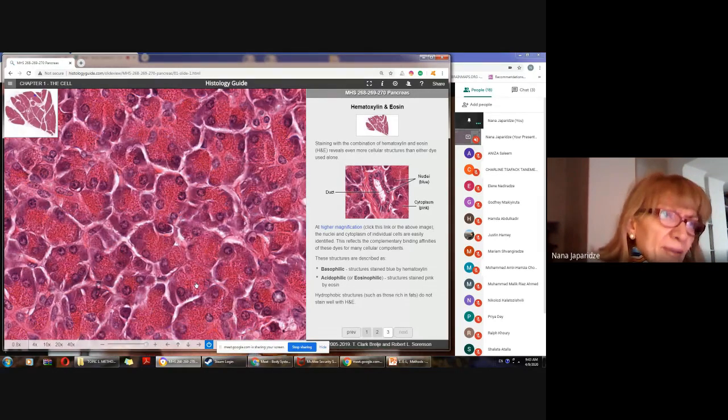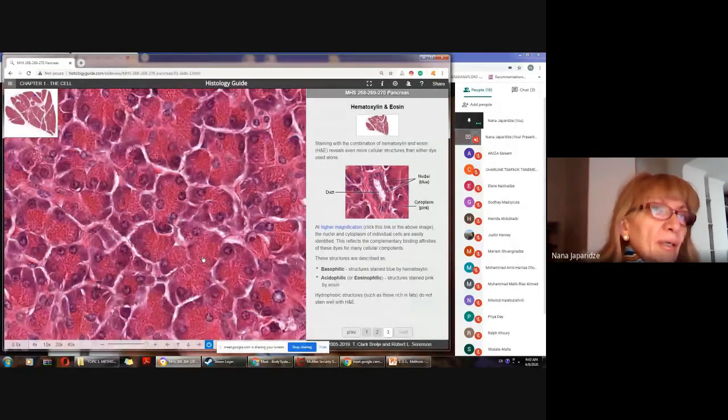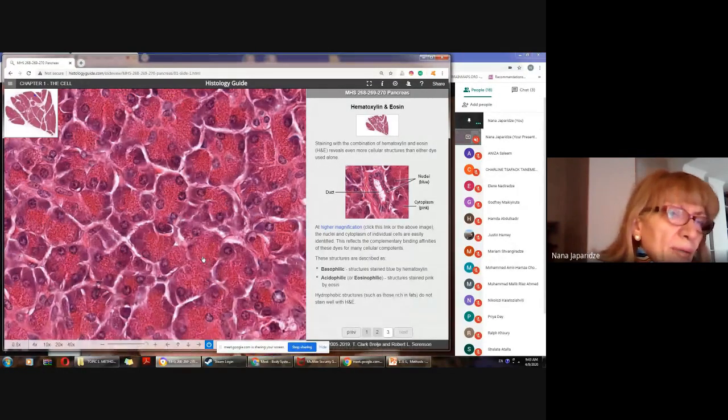Why does it happen? Why do the profiles of this or that cell have no nucleus? How do you think? Of course, due to the plane of section. In these planes of section, the nuclei are included. Here not. They might be above or below the plane of section.